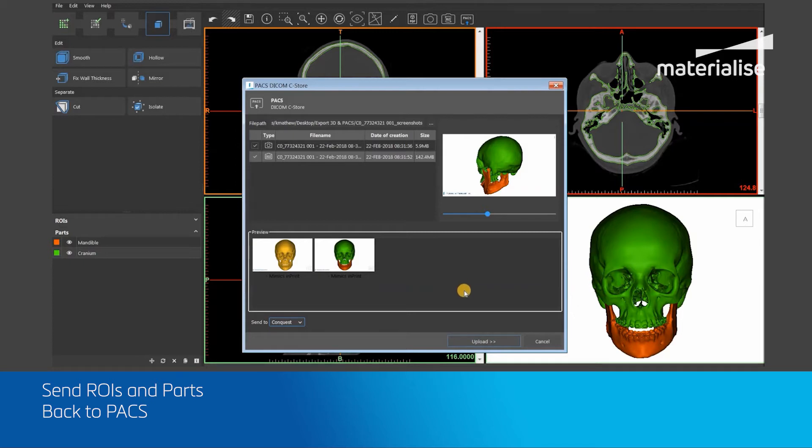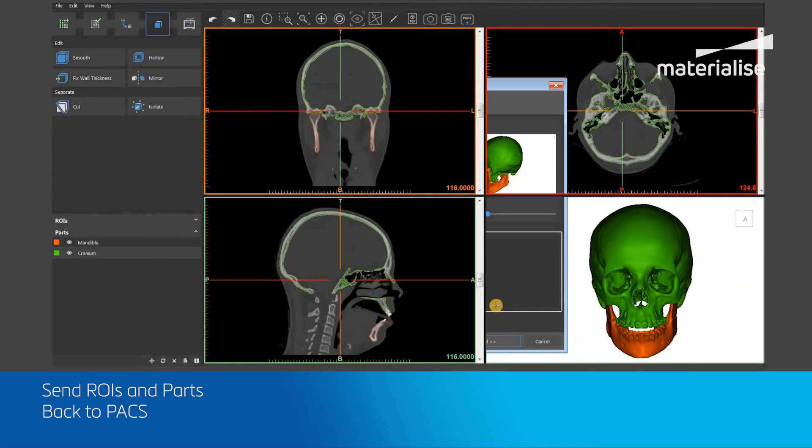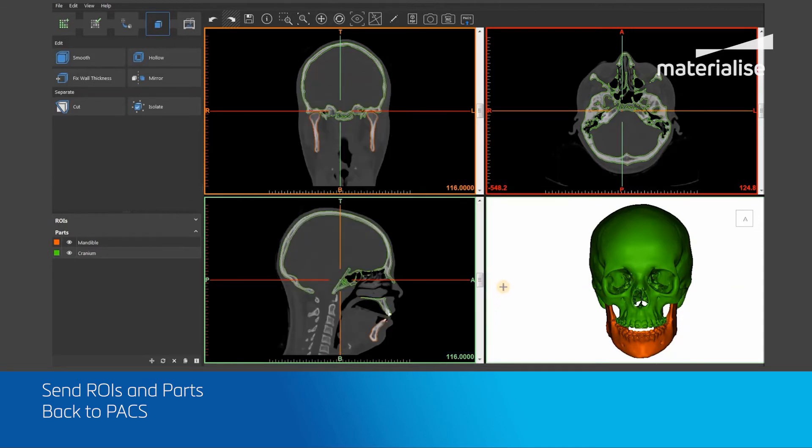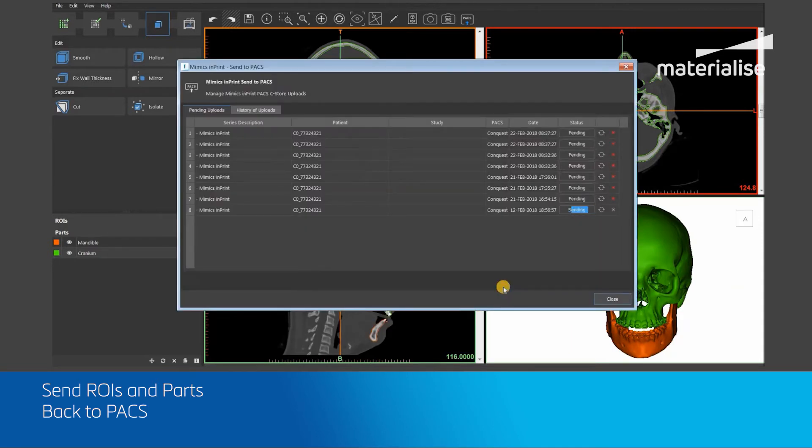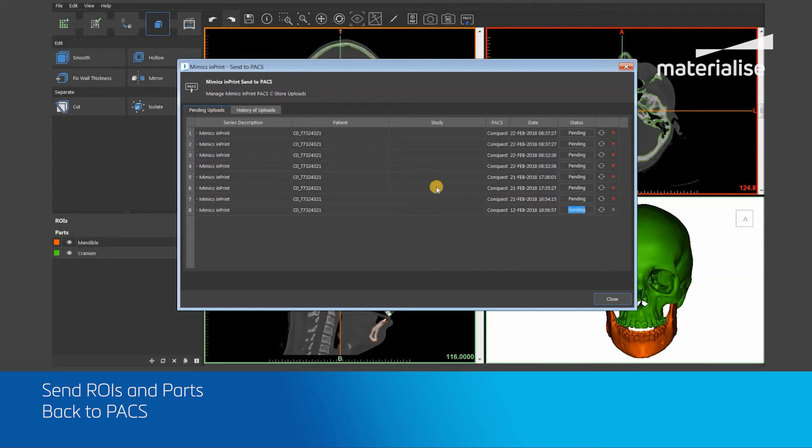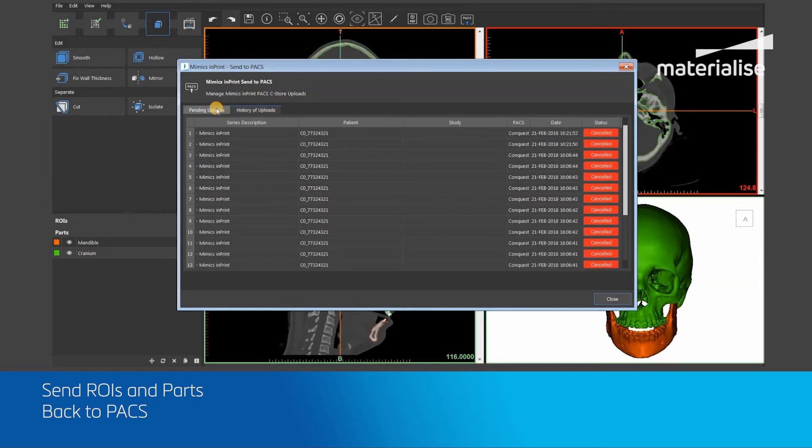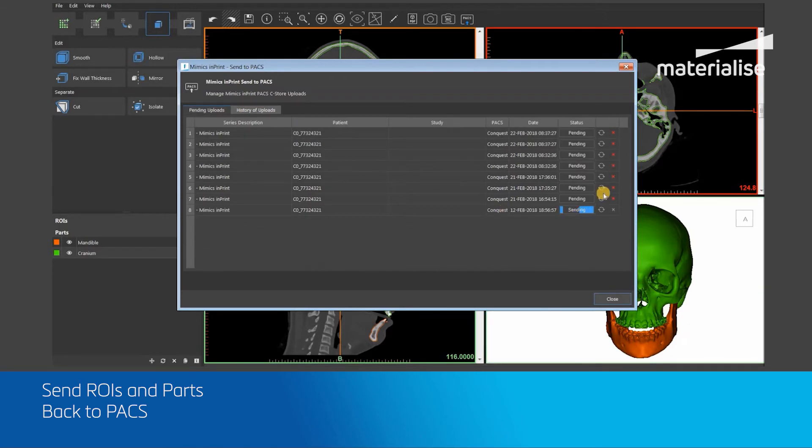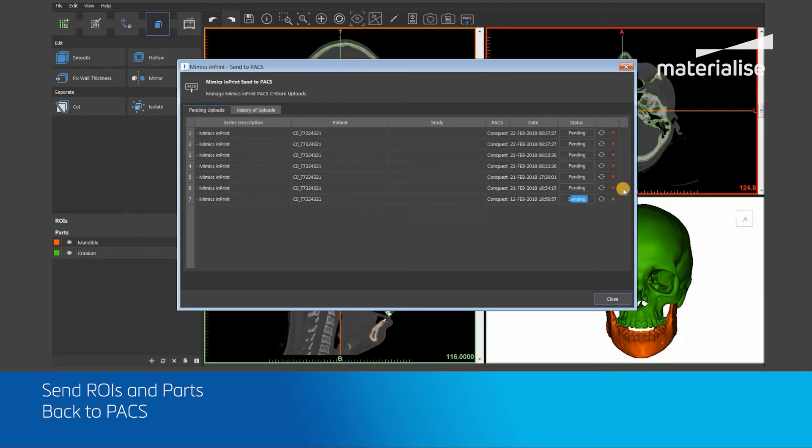Once the Upload button has been clicked, a new Send to PACS dialog box will open. This dialog box will show you all pending uploads and a history of all previously uploaded files. In order to cancel a file upload, you can press this red cross button.